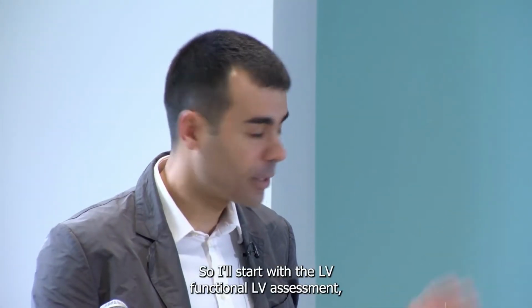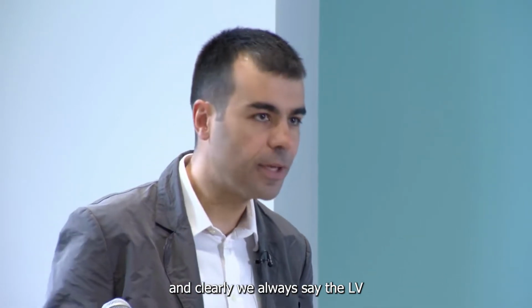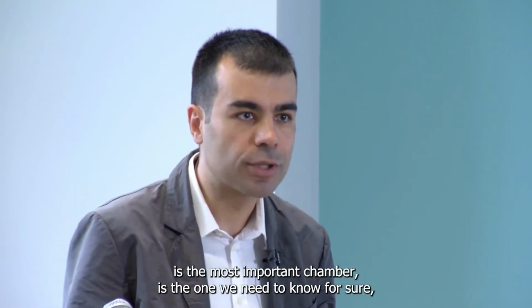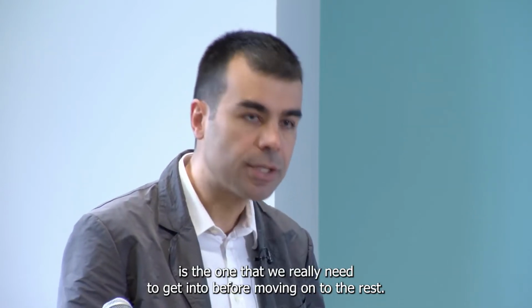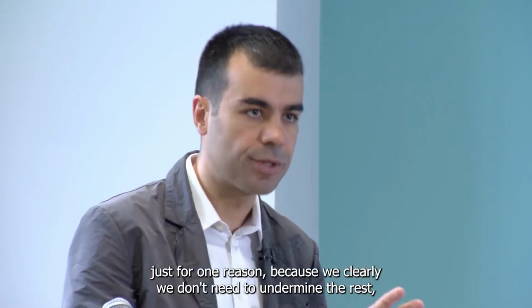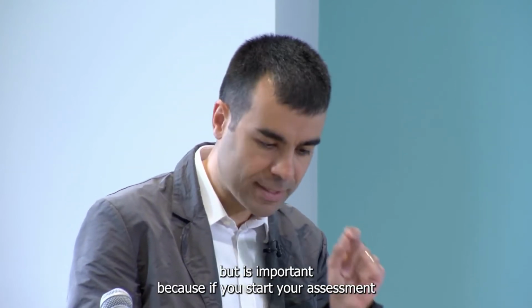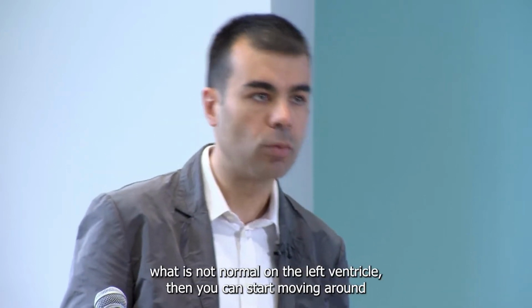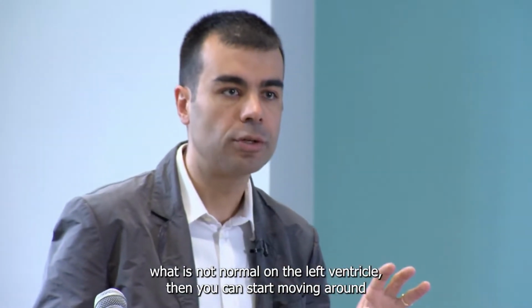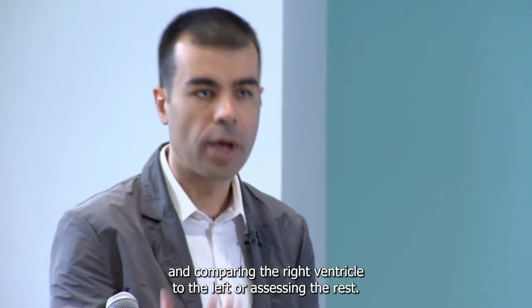So I'll start with the LV function, LV assessment, and clearly we always say the LV is the most important chamber, the one we need to know for sure, the one that we really need to get into before moving on to the rest. In a way, it's true just for one reason, because we don't need to undermine the rest. But it's important because if you start your assessment from the left ventricle, if you start assessing what is normal and what is not normal on the left ventricle, then you can start moving around and comparing the right ventricle to the left or assessing the rest.